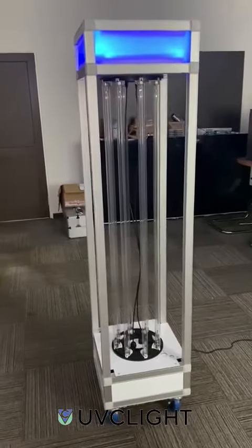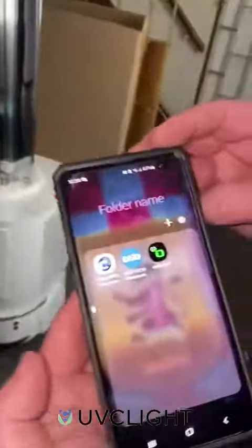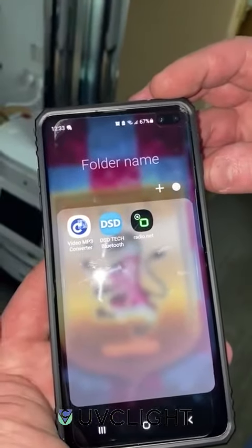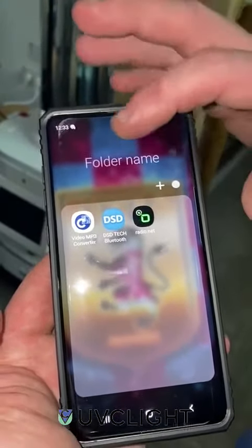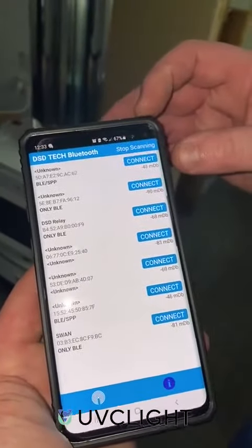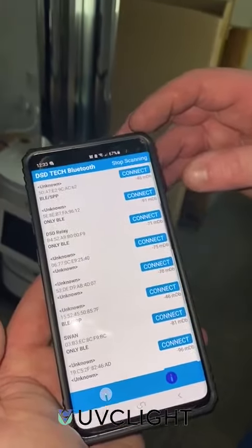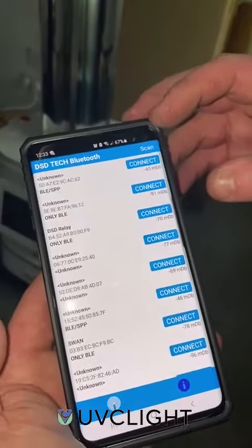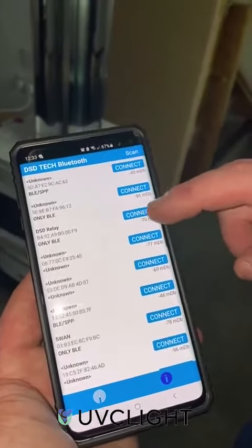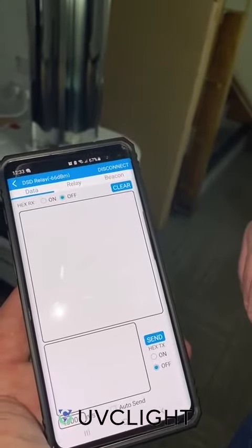How do you use it? You would need to download an app on your mobile called DSD Tech. Once you download it, you login and scan for the robot which you shall be using. Mainly it will come up as DSD Relay. You connect to it, and once connected, you go on Relay.